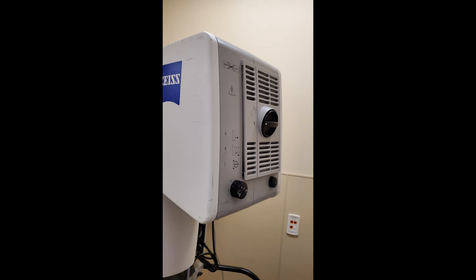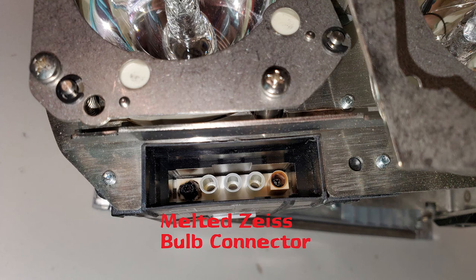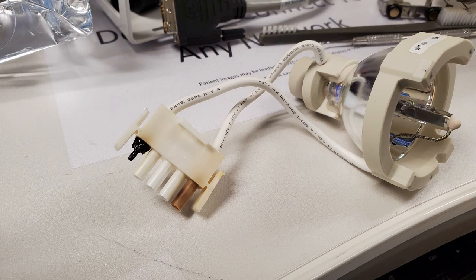Here's a Zeiss OPMI microscope I spotted in an operating room — notice how the lamp assembly is slightly ajar from the back of the microscope. When the lamp assembly is ajar like this it won't ignite, because a micro switch detects when it's fully inserted. I couldn't eject the lamp assembly because it was stuck; the black eject button at the bottom wouldn't respond no matter how hard I pressed or jiggled it. I took it to my shop, pried the lamp assembly free, and immediately noticed melted connectors. You can see the XBO bulb's pin that is obviously melted, and the other pin isn't much better.